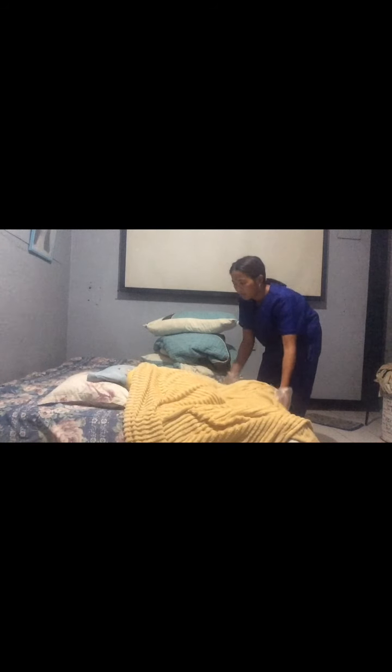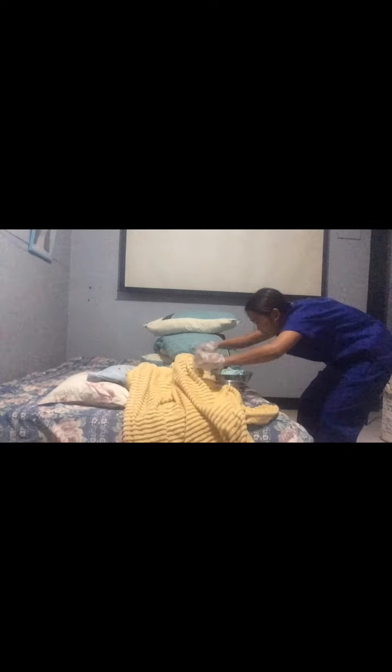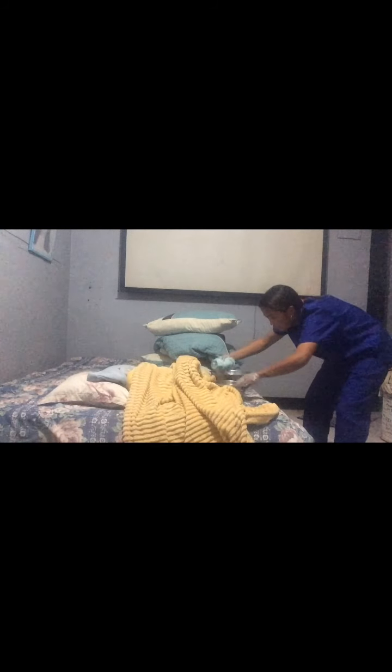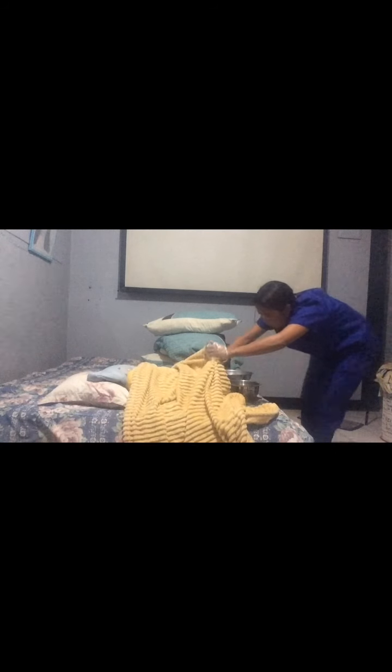Wear clean gloves. Position the client and place the bedpan. Wash the perineal area with proper technique.